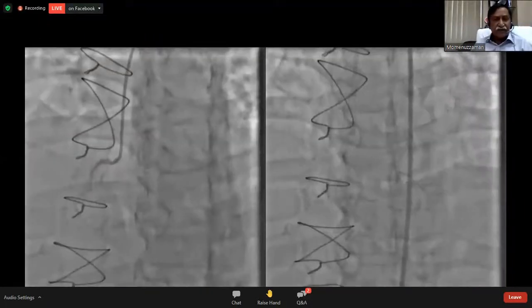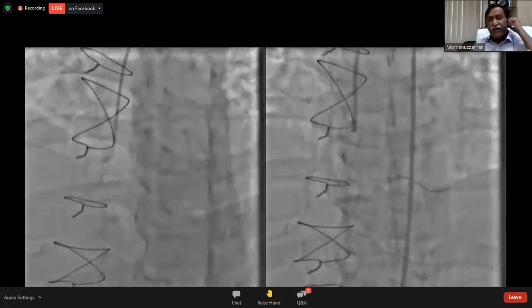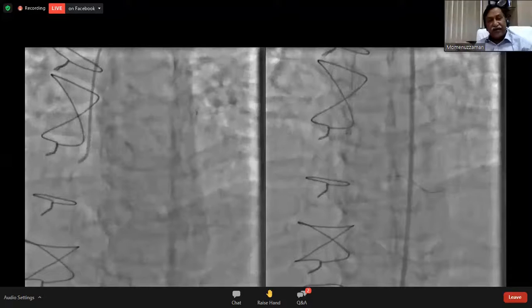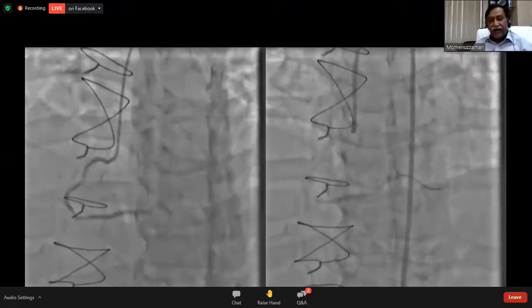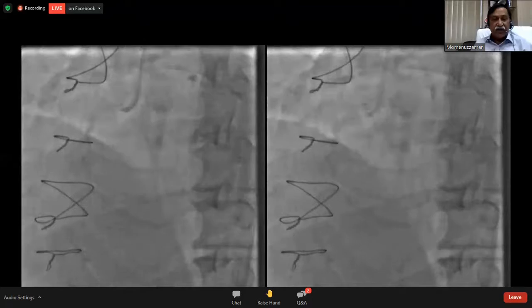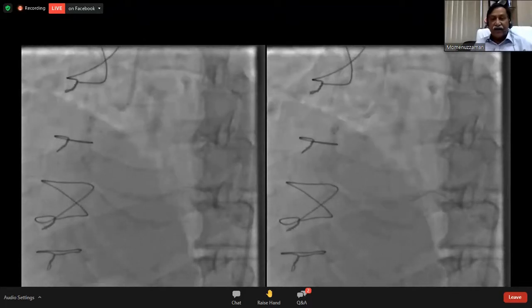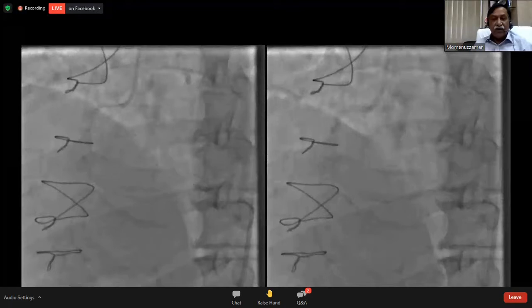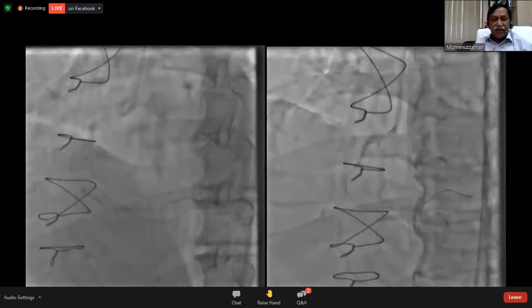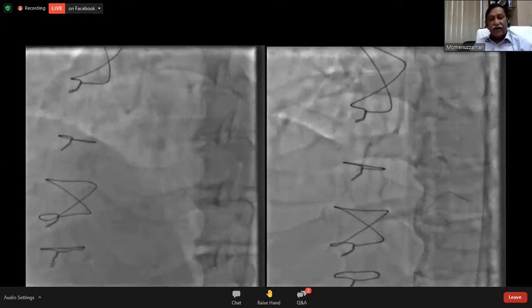This is a patient post CABG that was stented before in the distal RCA. You see the proximal and mid segment is completely calcified. You can see the whole vessel. After this, I tried to see by IVUS, but failed to cross the lesion. Then I dilated the vessel with a 2 mm balloon. Then at the proximal segment, I see that there is an indentation, meaning that the vessel has not been well expanded.